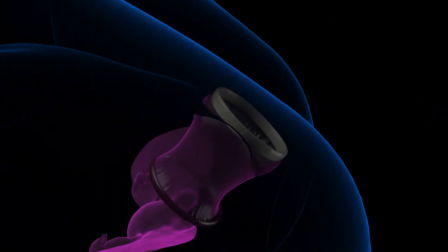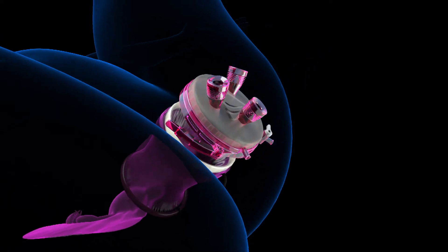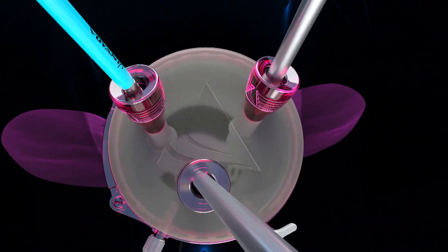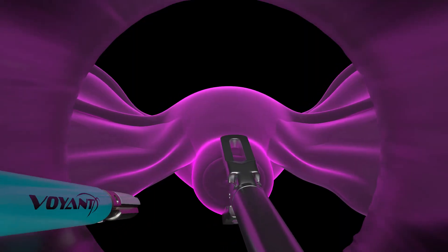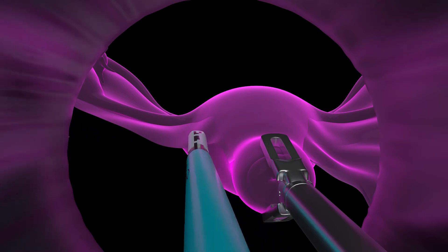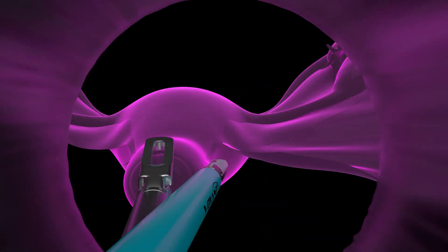The gel seal cap is secured to the Alexis retractor by closing the lever, and the insufflation tubing is connected to the insufflation port on the gel seal cap. After the patient is placed in Trendelenburg, dissection is performed caudally to cranially until the specimen is mobilized.